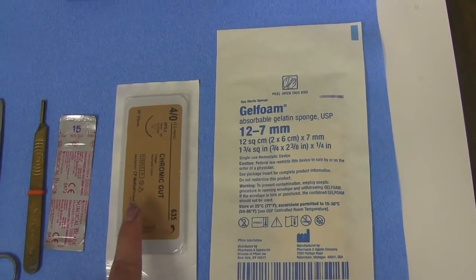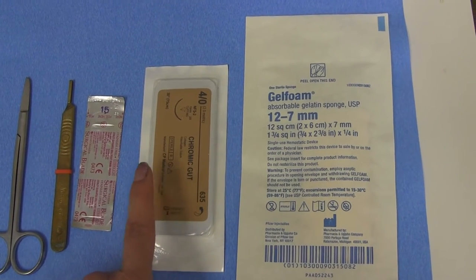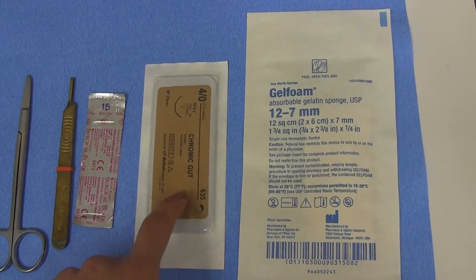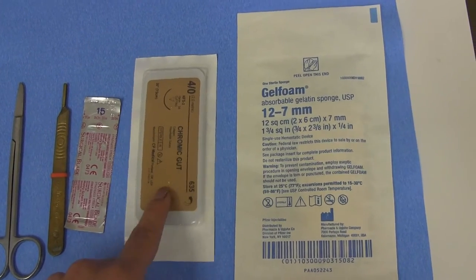It is always important to let the patients know when we are using the dissolvable sutures that they do dissolve, and that the patient doesn't need to come back to have sutures removed.